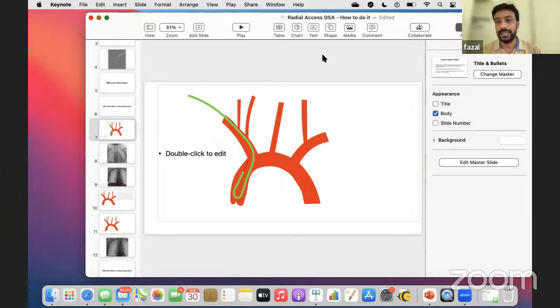What we did was we took a 6/7 Slender and we put a 6 French Envoy, and we took a 043 Fubuki, and we took a Phenom 21 and a Solitaire. But the problem is that there was a great amount of resistance pushing the Solitaire to the clot. So for the 081 we have ordered a 7 French Ready Focus and an 081 Fubuki, 7F Fubuki. 7F Fubuki is out of stock. We are not able to get it. I think I got all the 7 French Fubukis for myself.